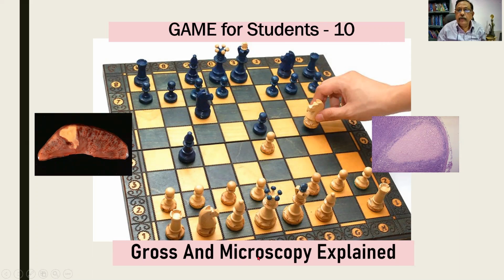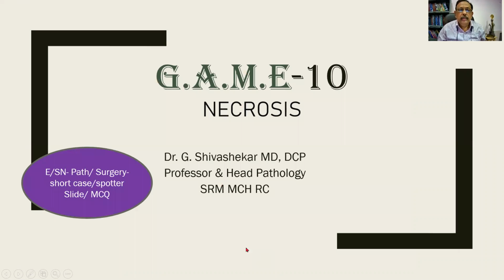Gross and microscopy explained. The topic for the day is necrosis. Though I am going to restrict myself to the gross and microscopy, you should remember that it can be an essay, a short note in pathology or surgery, a short case again in surgery, spotter, slide in the practicals, and an MCQ in either subject.